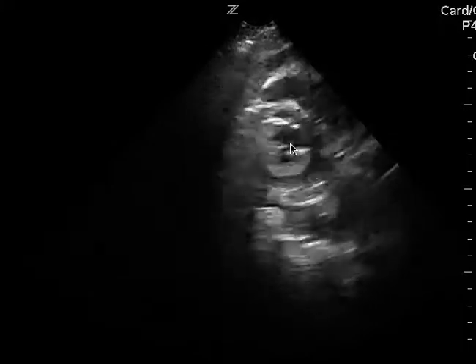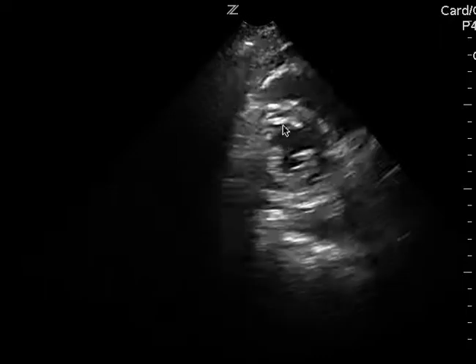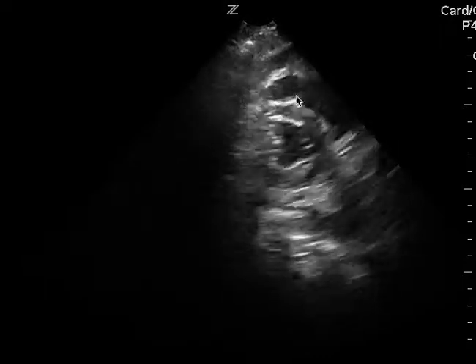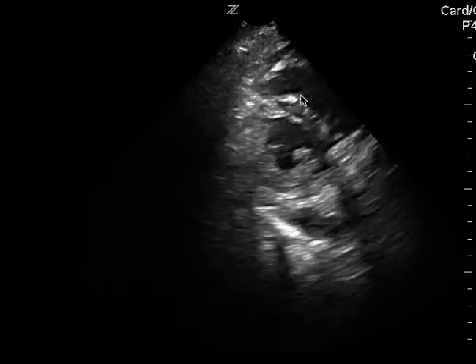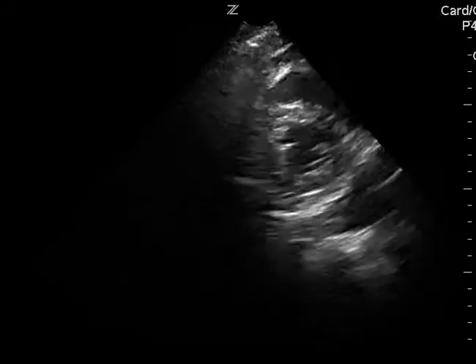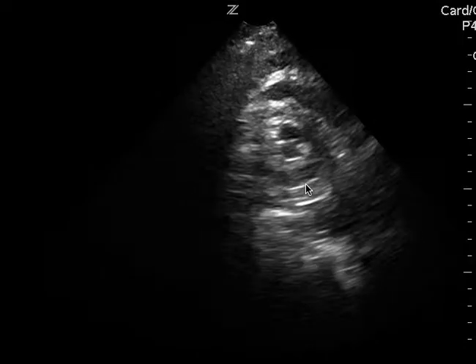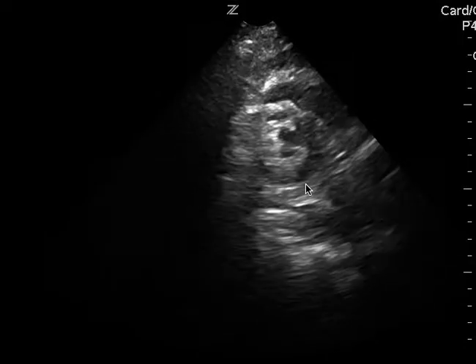This is the distal portion of the heart, where you see more of the apex here in cross section and short, and then this is your RV here. And so it seems that the EF seems to be intact. But because I don't see the papillary muscles, I shouldn't comment on the ejection fraction. I need to see the papillary muscles in view.